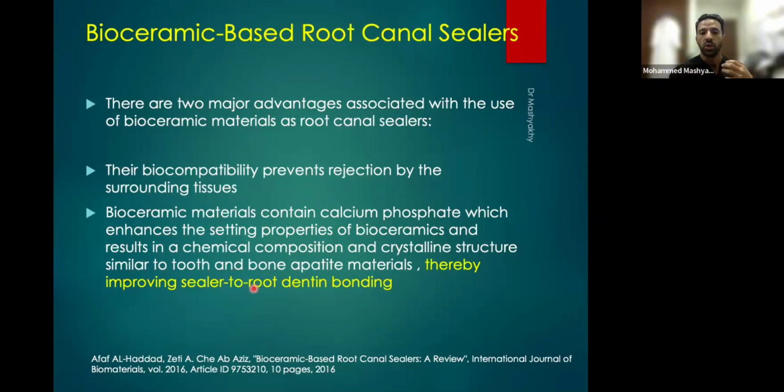Okay, so the concept behind the bioceramic sealer, MTA sealer, or this kind of sealer is to have a sealer around all the root canal system, and the cone is something to facilitate the sealer going all the way around, and the cone will go in the middle. So whenever you need retreatment, you can go through it, and it will work as a hydrodynamic.